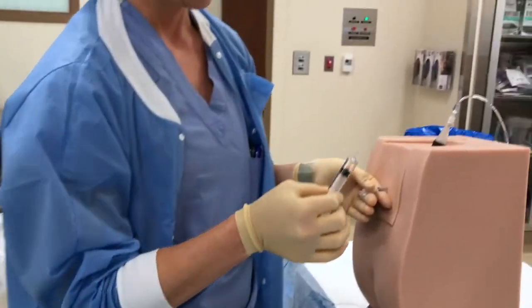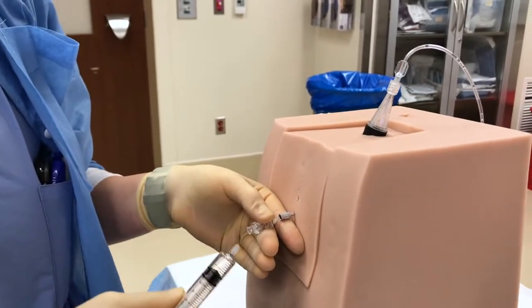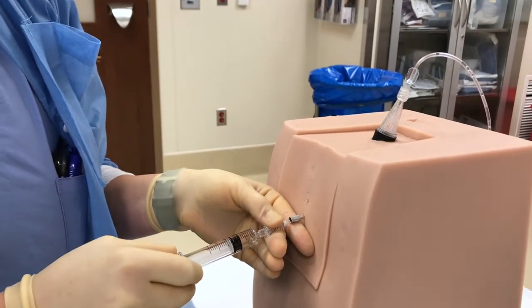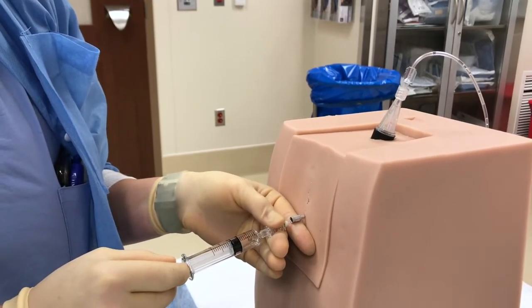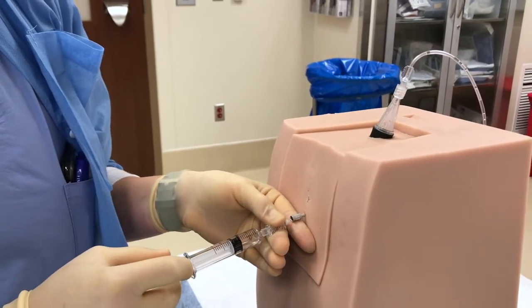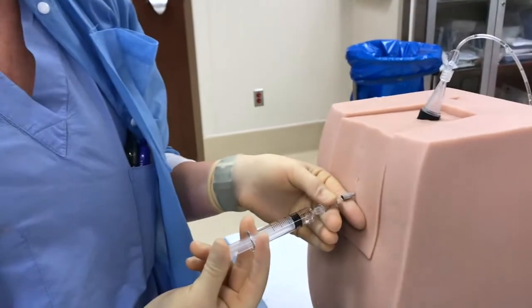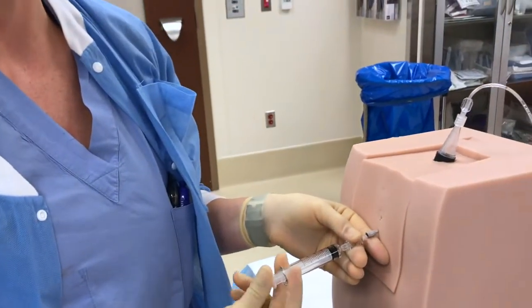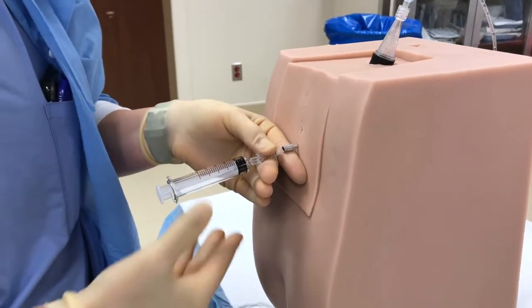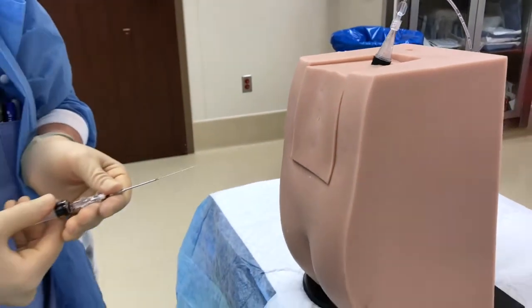Once you see CSF, just before it starts to drip down, you carefully grab your spinal injection and very carefully, again, without moving these, because any millimeter advancement or withdrawal can potentially lose the space, carefully attach the needle. Some people like to carefully withdraw. Oh, see, I can withdraw spinal fluid, yeah. Carefully withdraw it with the hyperbaric bupivacaine, the 0.75%. You can see a swirl here, and then you would inject your solution. And then at the end, some people also like to confirm with a swirl. Once the spinal injection is completely in, you grab all of your components and in one fell swoop withdraw everything.